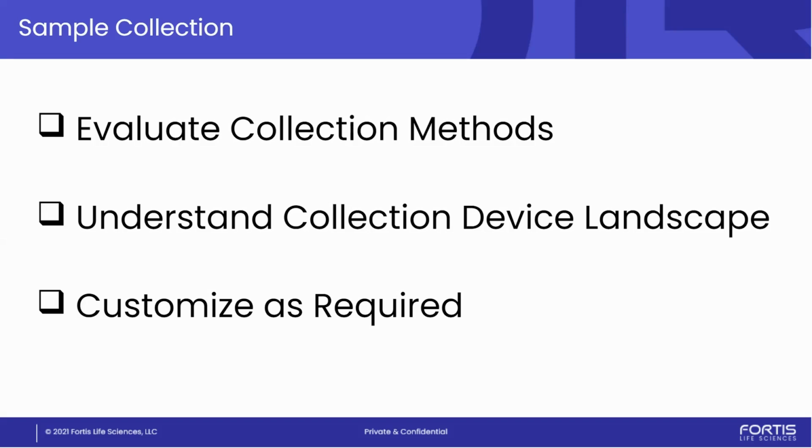There are companies and CROs that will develop custom methods of saliva collection, whether that is a nylon swab or a cotton swab, and how it's attached to what length of stem. Is it a breakable stem? All of those things can be customized.